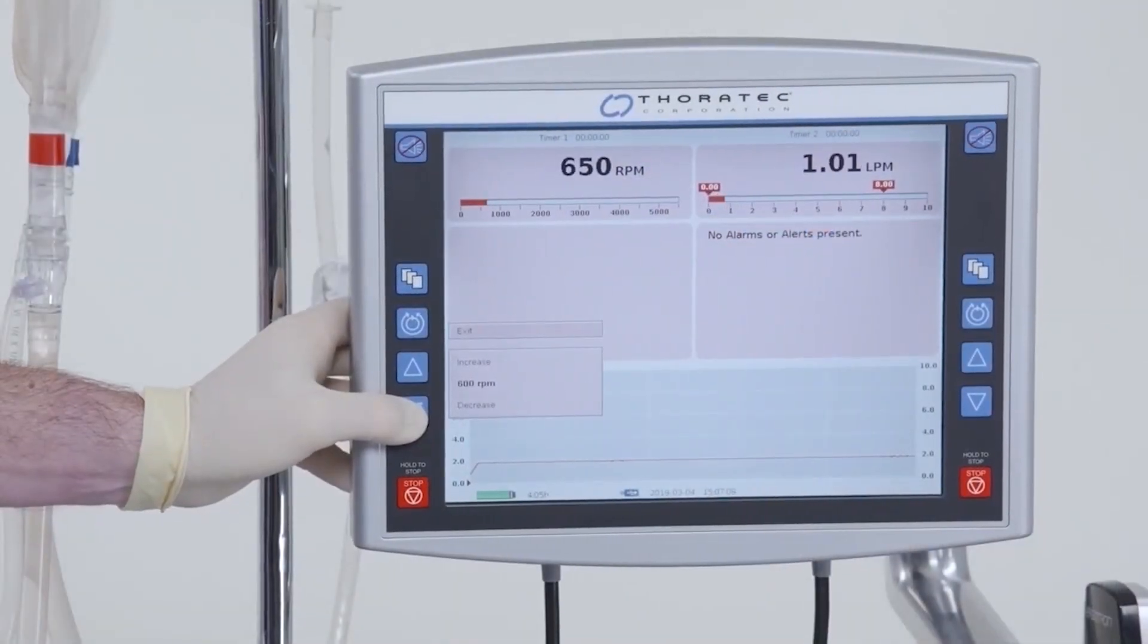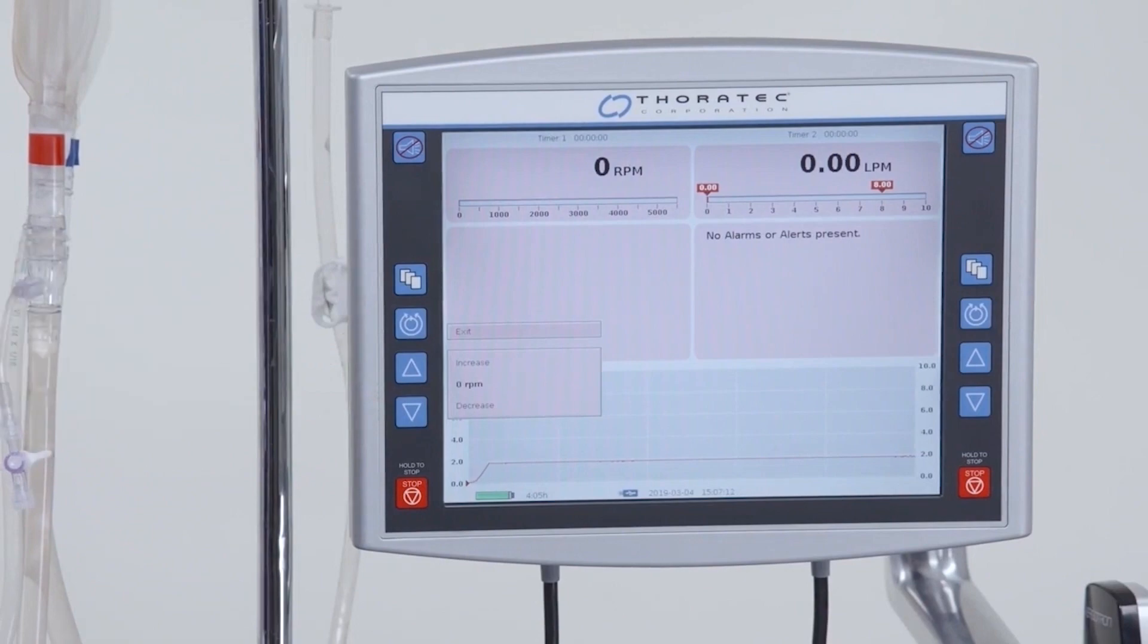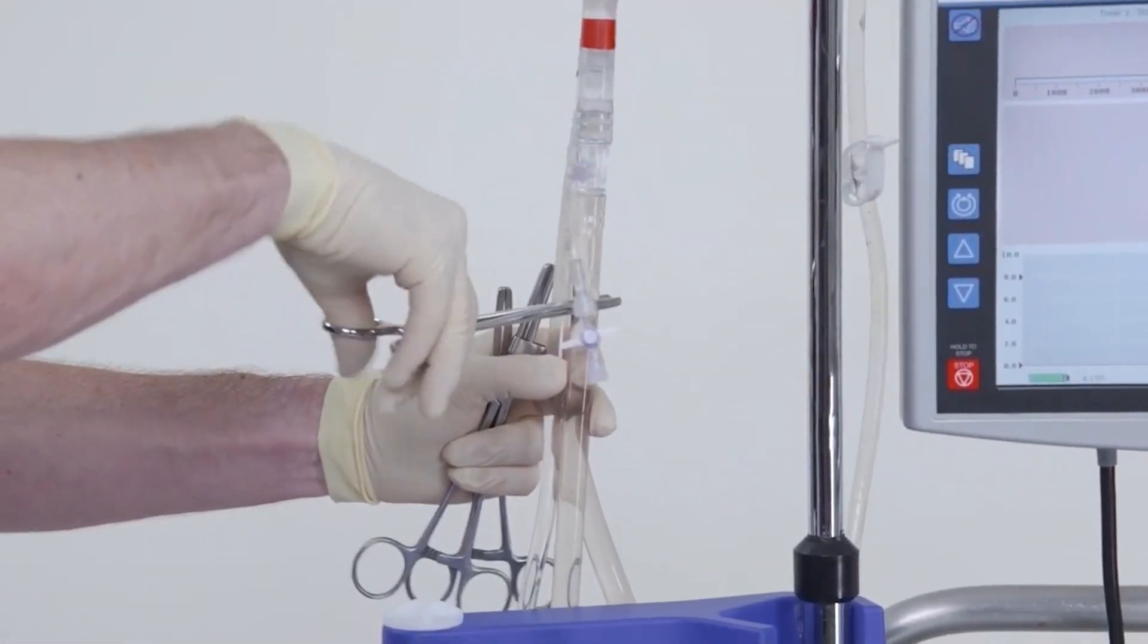Gradually reduce the RPMs to zero, then stop the pump and clamp the lines.